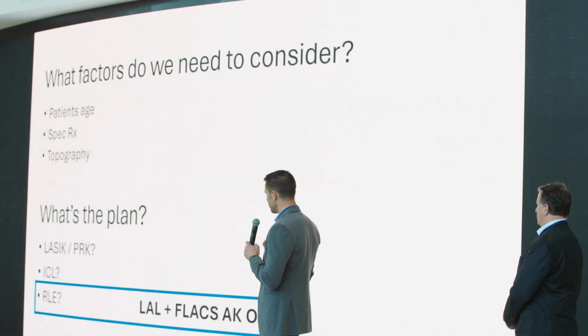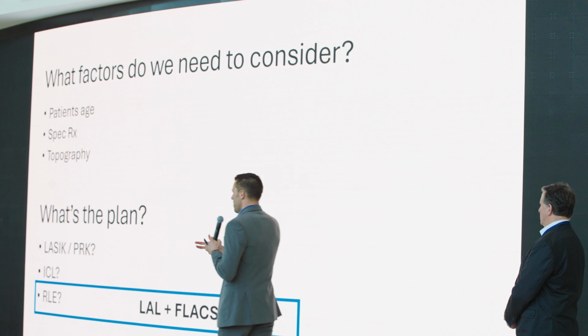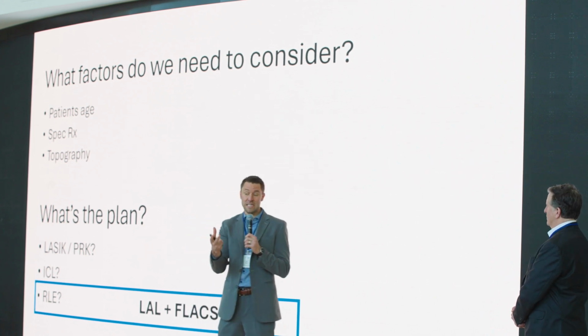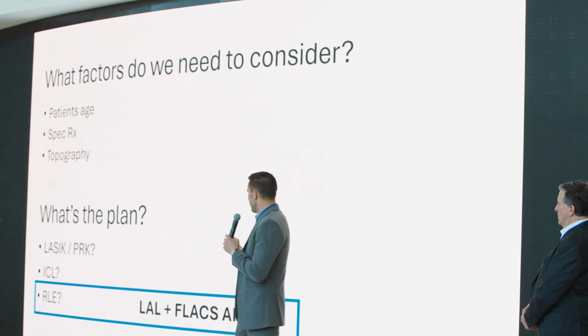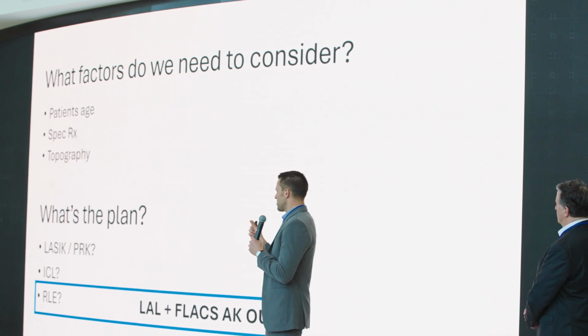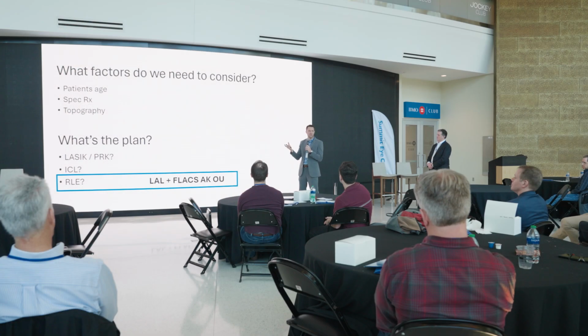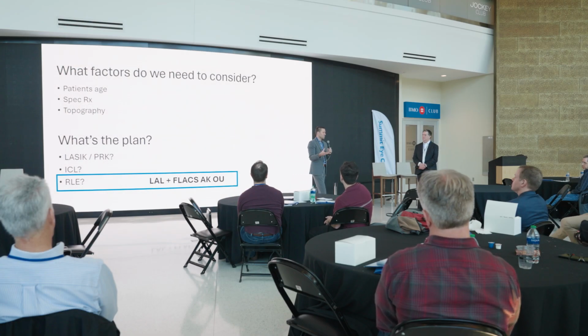Well, with him, we wanted to get a little depth of focus because he is young. He's never been a presbyope before. So we ended up doing LAL. And this is not an LAL talk, but it does give us the depth of focus that he needed. Now, the thing about the LAL is that we can only get about 2 diopters of cylinder. With him, he was expected to have about a diopter to a diopter and a half of residual corneal astigmatism.